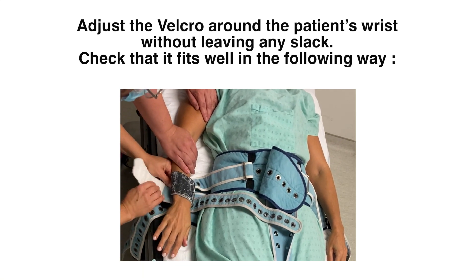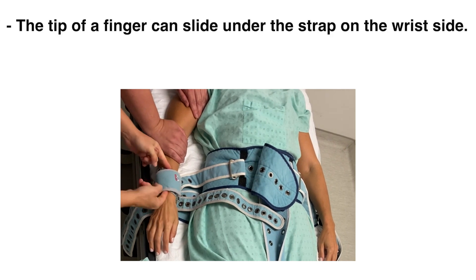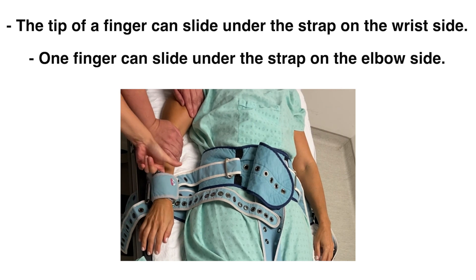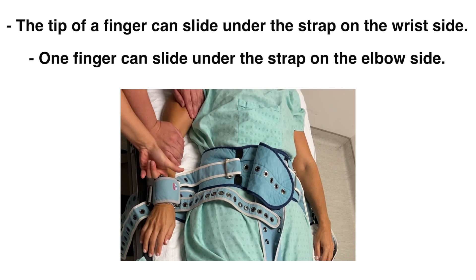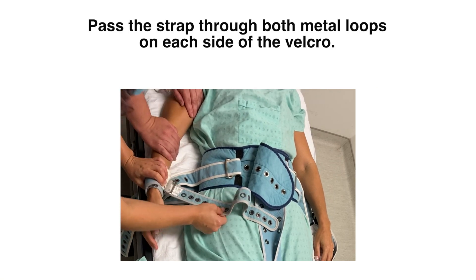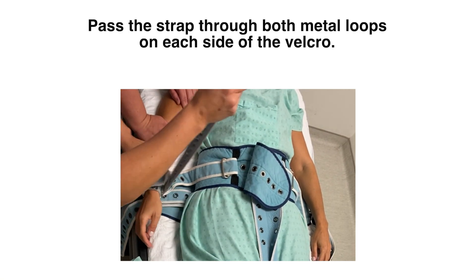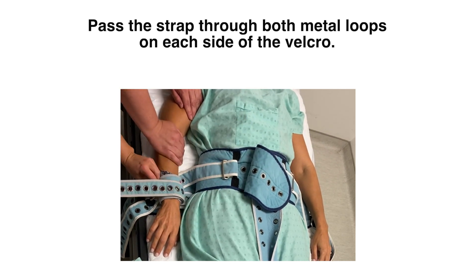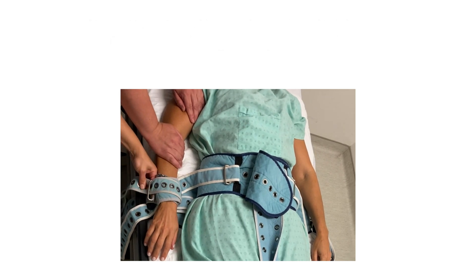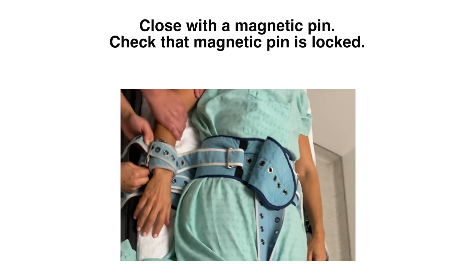Check that it fits well in the following way: the tip of a finger can slide under the strap on the wrist side, and one finger should be able to slide under the strap on the elbow side. Pass the strap through both metal loops on each side of the Velcro. Close with a magnetic pin and verify that the magnetic pin is locked.